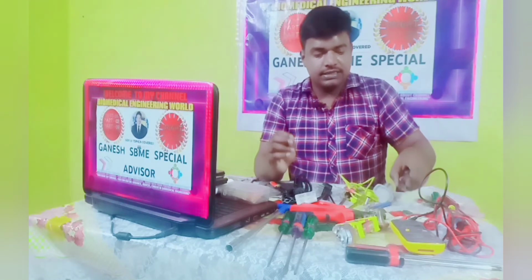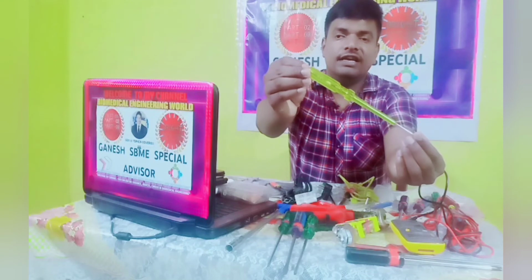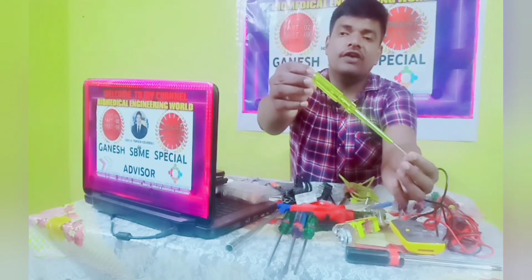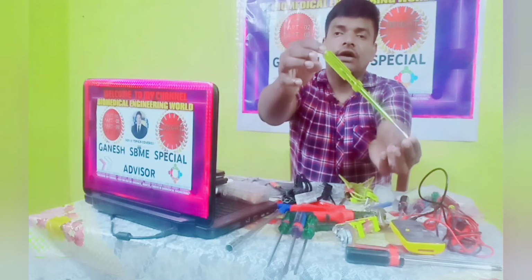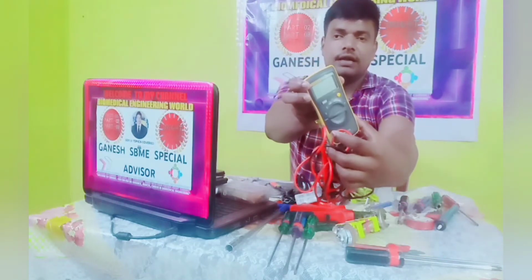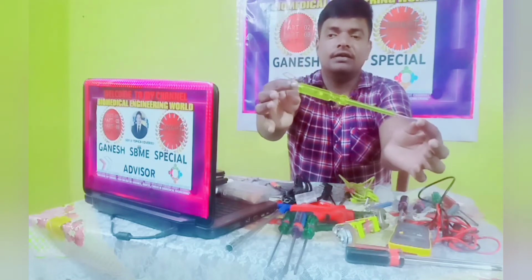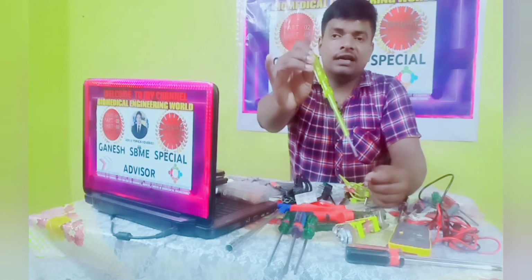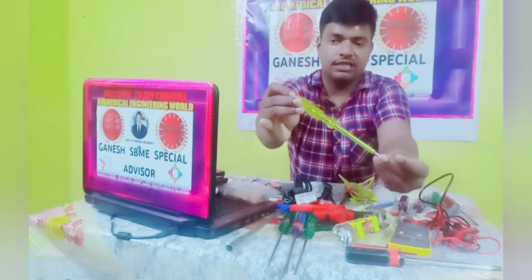And one more thing is the tester. We know very well the tester. Actually, this is basics, mostly available with an electrician. But as a biomedical engineer, we have a multimeter. In some cases, though, a multimeter is not needed. With less time, we can check whether the power is coming or not, the absence or presence, we can find out. We know this one very well.